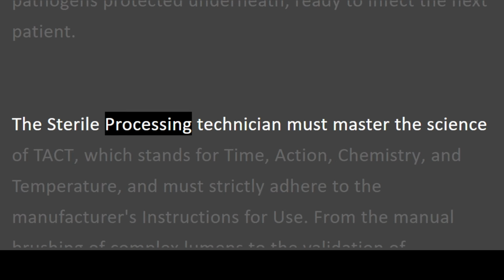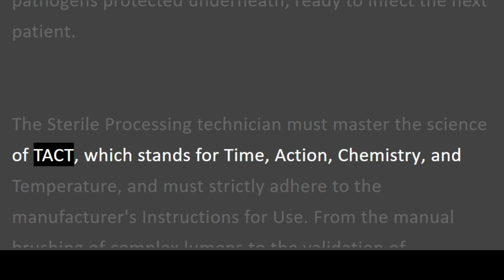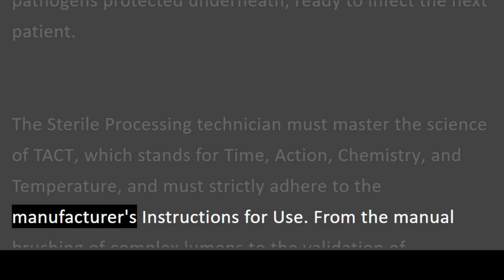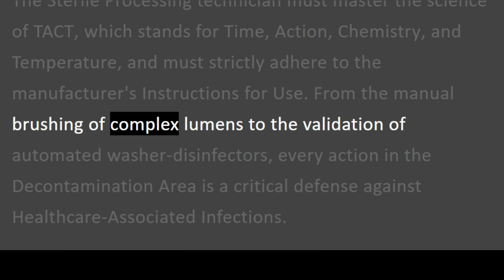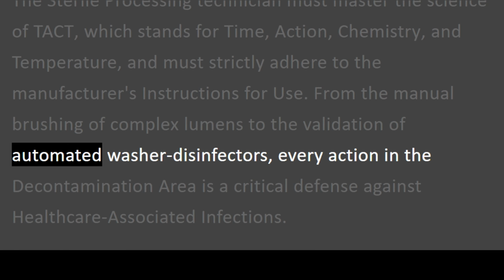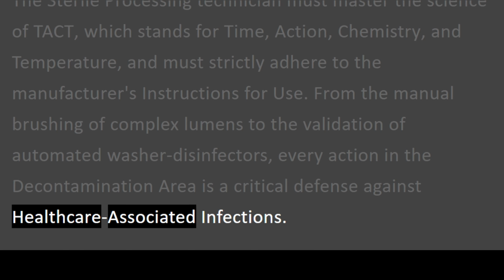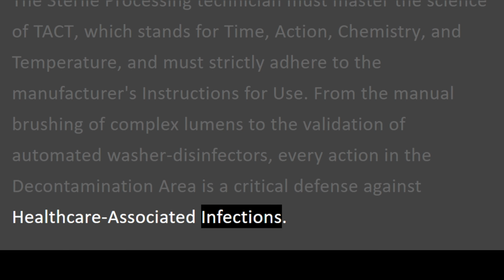The sterile processing technician must master the science of TACT, which stands for time, action, chemistry, and temperature, and must strictly adhere to the manufacturer's instructions for use. From the manual brushing of complex lumens to the validation of automated washer disinfectors, every action in the decontamination area is a critical defense against healthcare-associated infections.